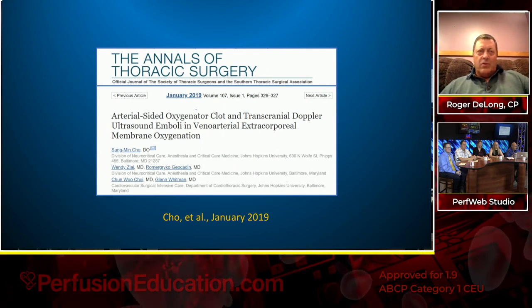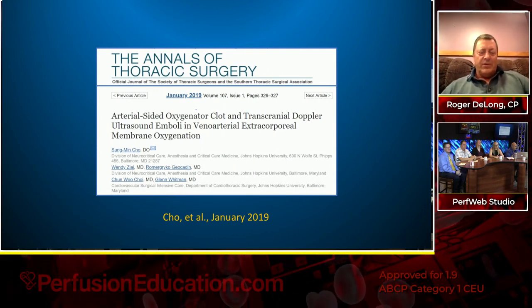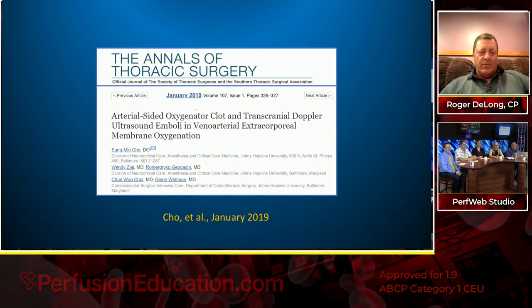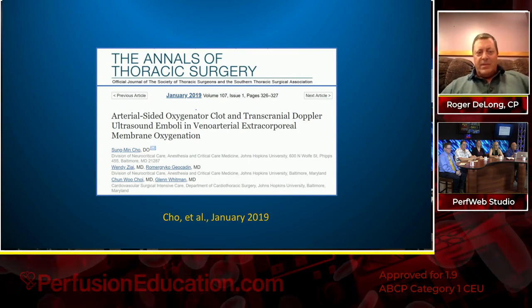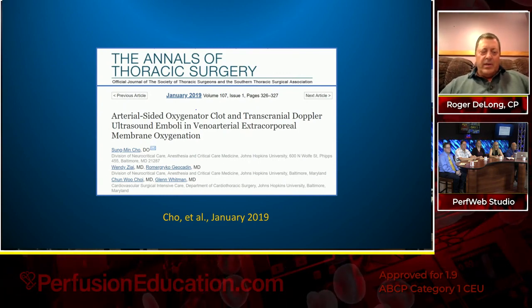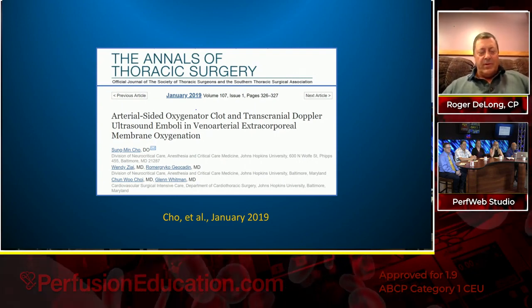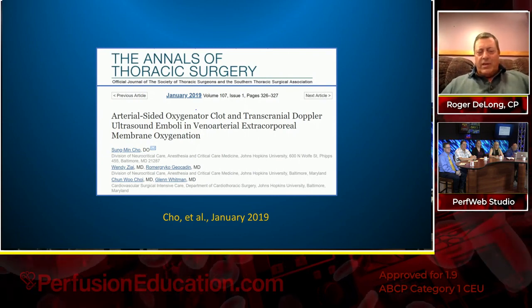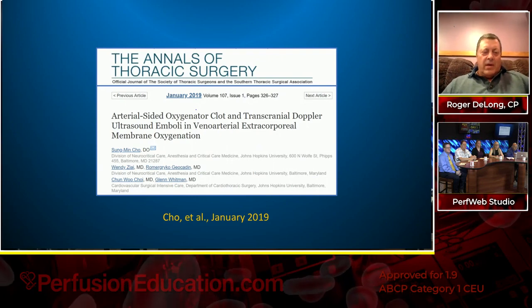He's been looking at strokes for all different types of invasive procedures. Recently, he's done papers on TAVRs and VADs with a positive correlation with an increase of microembolic signals with the increasing duration of the procedures. In this case, they had a heart transplant patient who wasn't doing well. They put him on ECMO. Next slide.